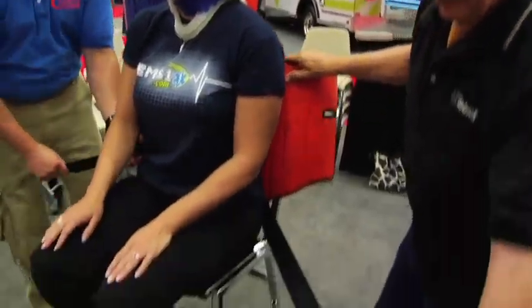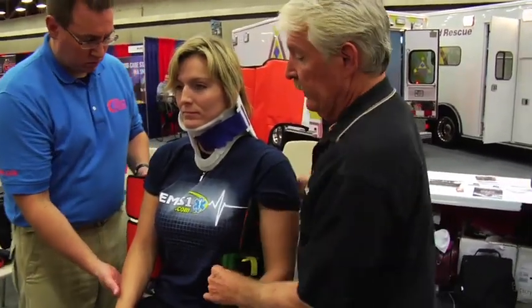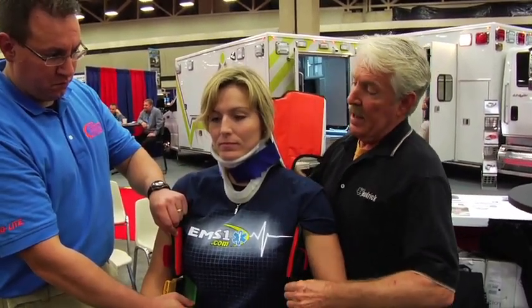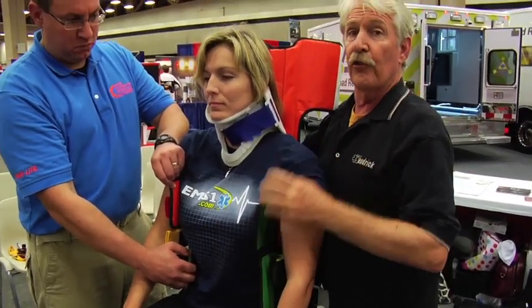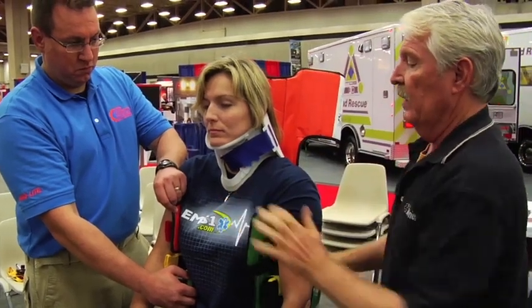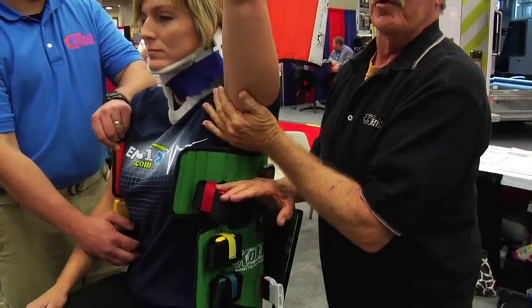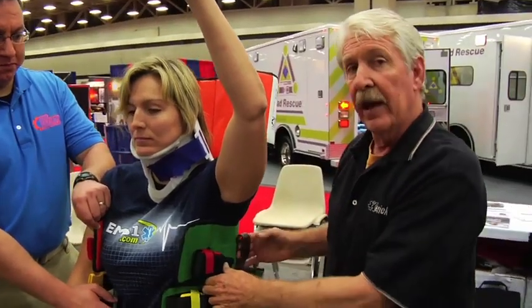Take the leg straps out and just put them out of the way. You wrap the side pieces around your patient. Here's one of the most critical points that you need to keep track of and not forget: you lift it up until you see it snug up under the armpits and the shoulders begin to almost shrug. You can see it's right up under the armpit — this is the lifting point. If it's snug up under the armpit, you'll be able to use these handles to move your patient.